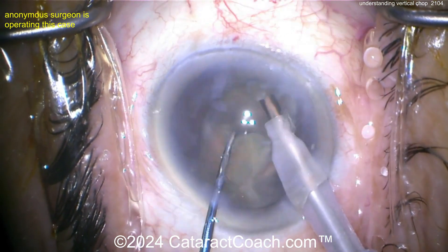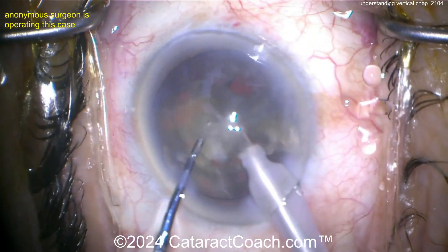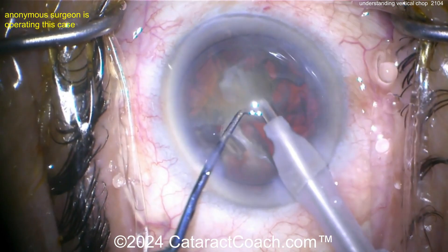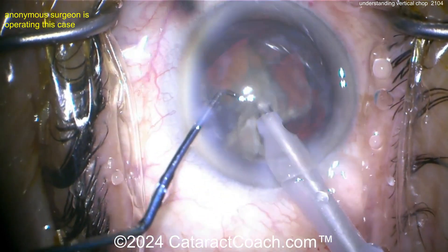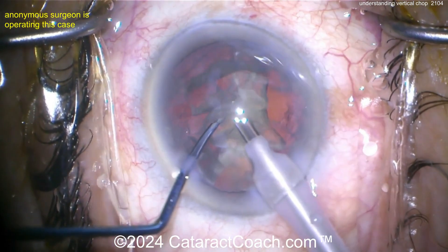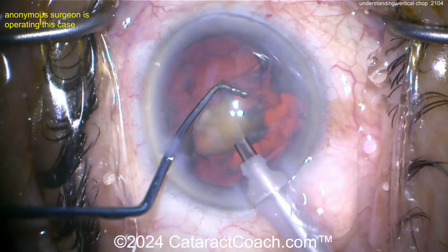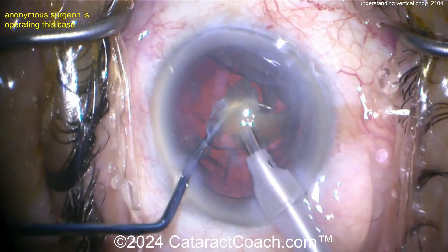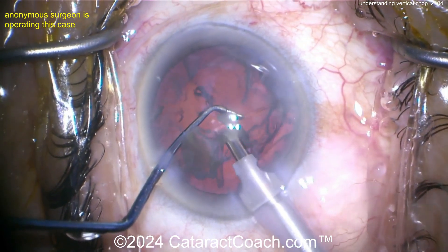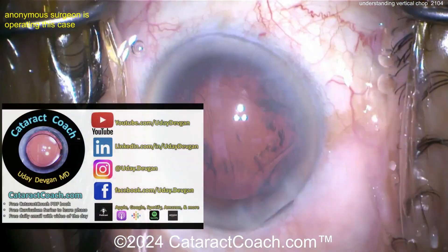If the chopper can't dig in — say you lose vacuum holding power — the whole nucleus just gets pushed backwards. That holding power is really important. There's a finite window of time to get the chop done. I like to go just sub-incisionally inside the rexis, get a strong hold on the nucleus with vacuum, then dig the chopper into the nucleus within the confines of the rexis, and pull the instruments apart to propagate a beautiful chop.